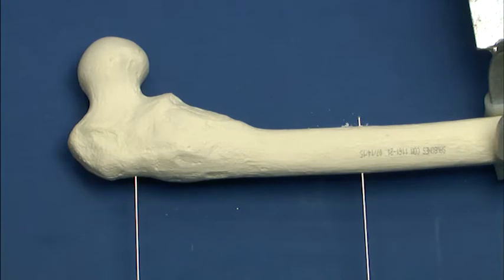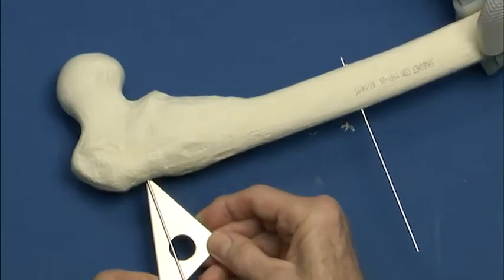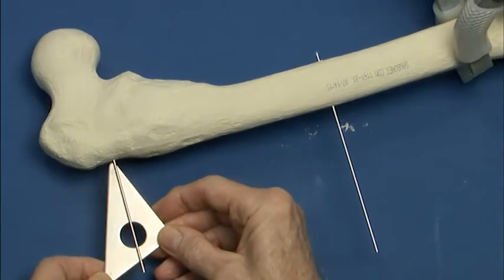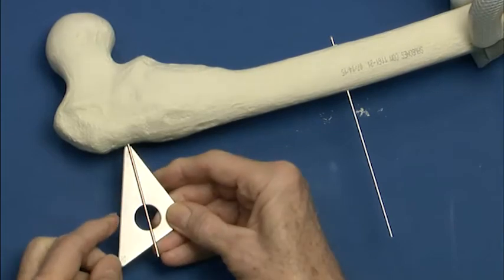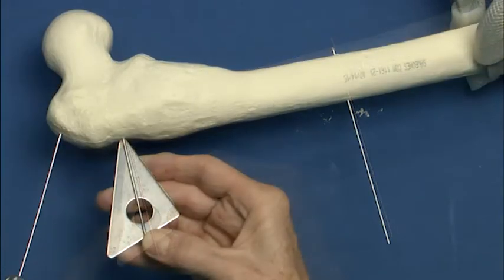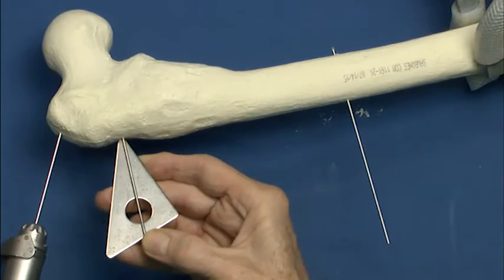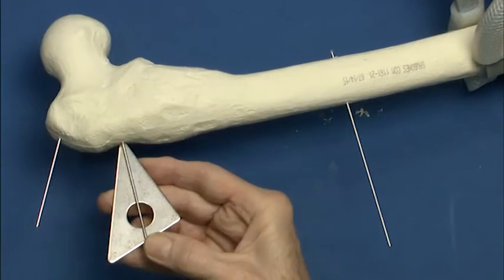And now what we're going to do is bisect a 40-degree angle for our reference. So this, you have to take my word for it, does say 40. And so our reference is then going to be parallel to this superior surface. And I've pre-drilled this. I think we're close.